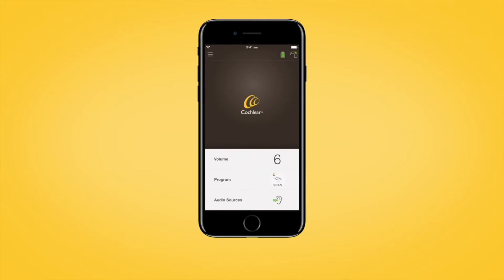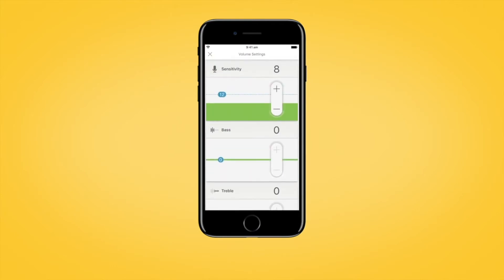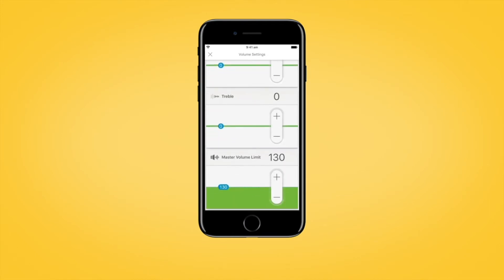To see these options, tap volume to open the volume control panel, then tap more to open volume settings. You can change the sensitivity, bass, treble, and master volume limit levels by tapping the plus or minus buttons.